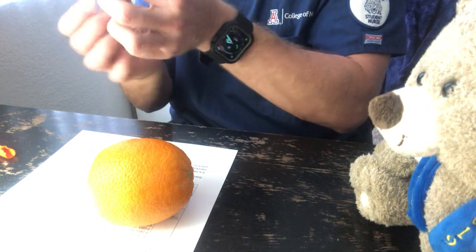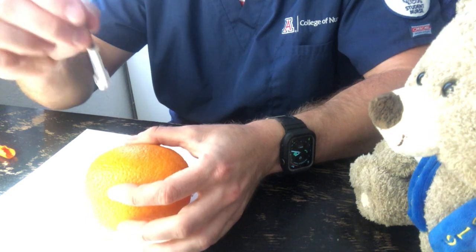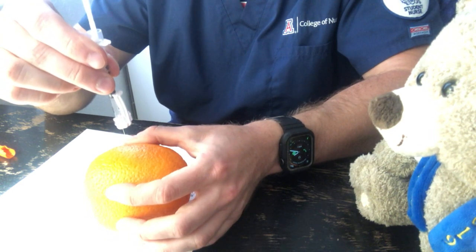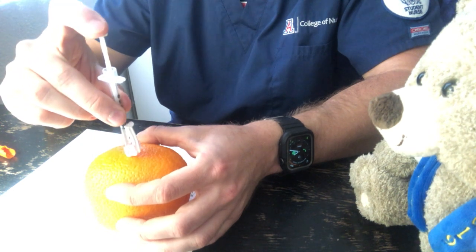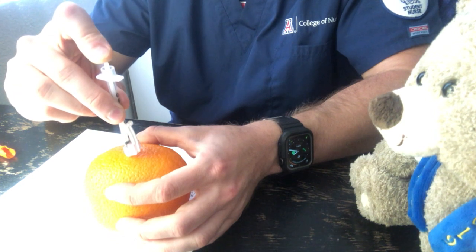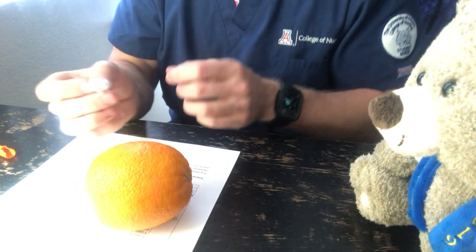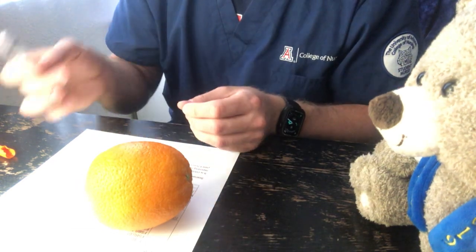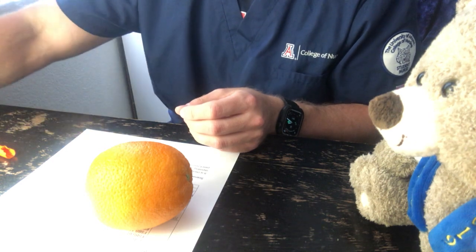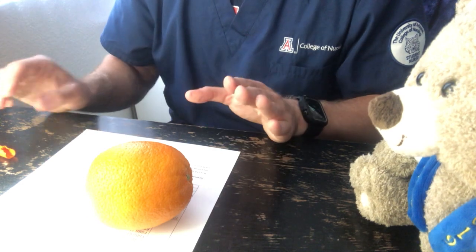I'm going to pinch the appropriate site. I'm going to go in at a 90-degree angle, dart-like 90-degree angle, administer the medication slowly, not too fast. Take it straight out, release. I'm going to engage the safety and then put this into a puncture-proof sharps container. So I'm done with that one.